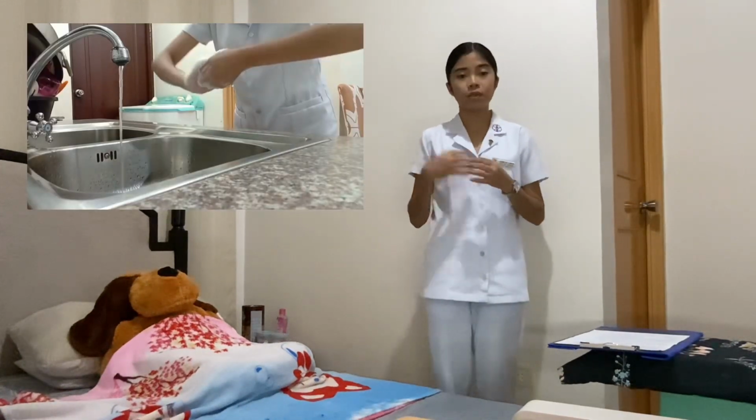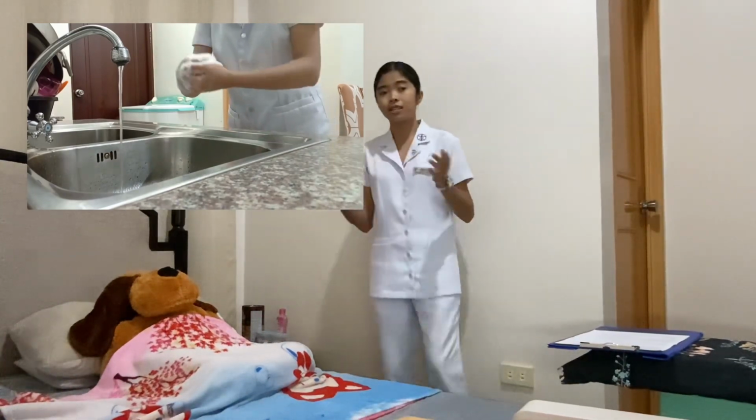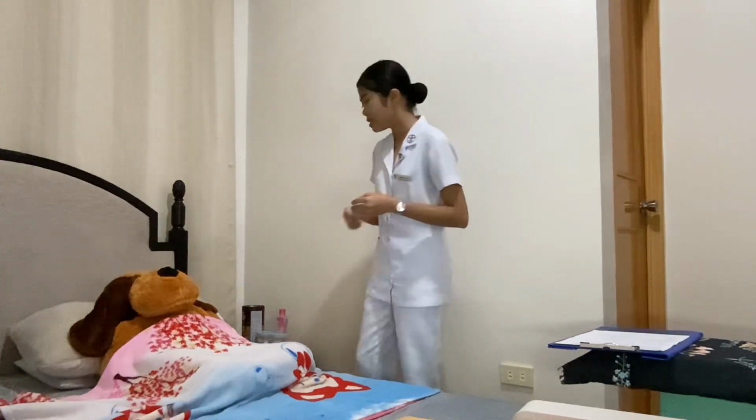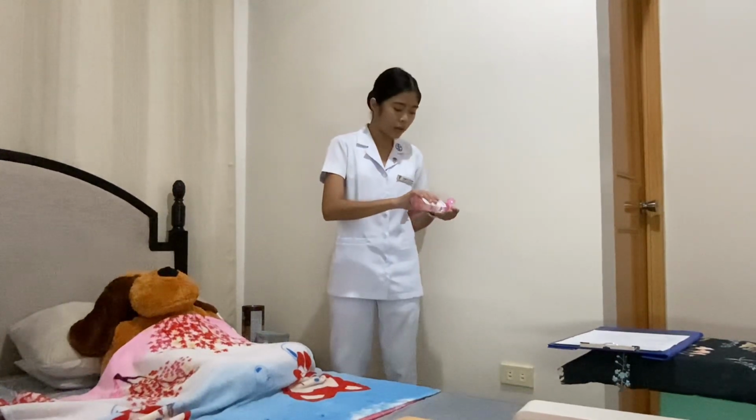So now before we start the whole procedure, we should first do the hand washing again to deter the spread of microorganisms and prevent infection and cross-contamination. Since we have already washed our hands, what we're going to do is just pour some alcohol in our hands.